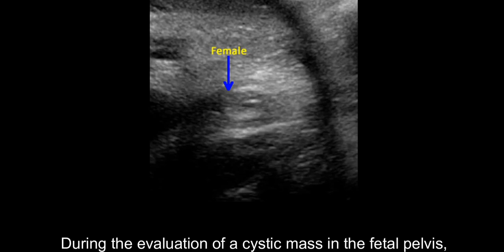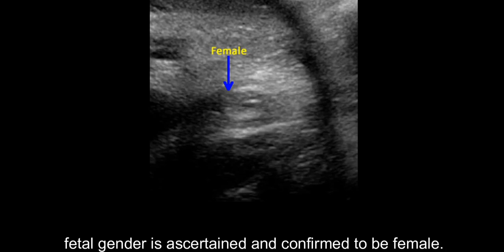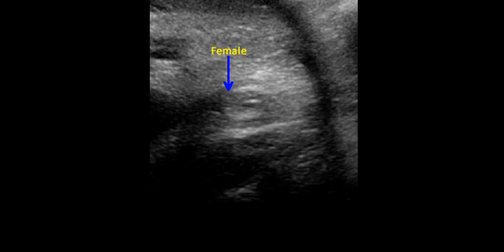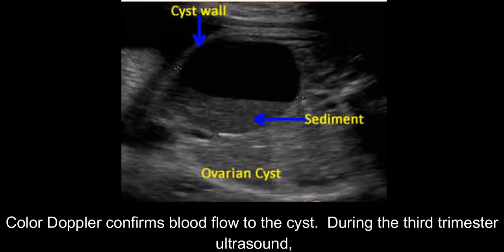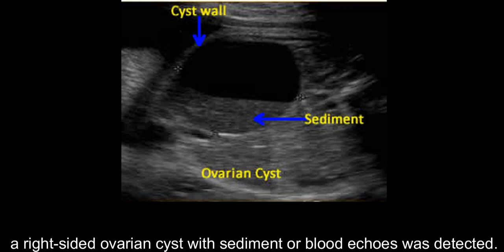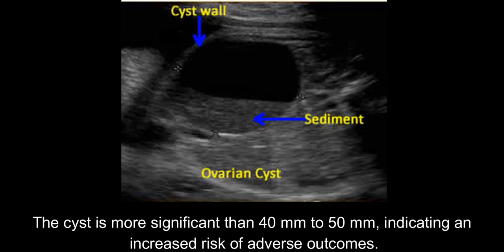During the evaluation of a cystic mass in the fetal pelvis, fetal gender is ascertained and confirmed to be female. Colored Doppler confirms blood flow to the cyst. During the third trimester ultrasound, a right-sided ovarian cyst with sediment or blood echoes was detected. The cyst is more significant than 40 mm to 50 mm, indicating an increased risk of adverse outcomes.